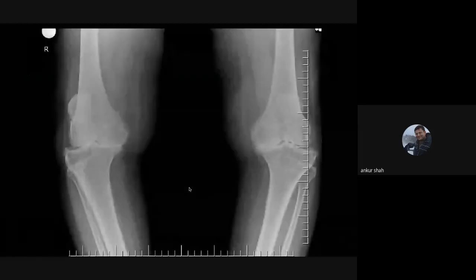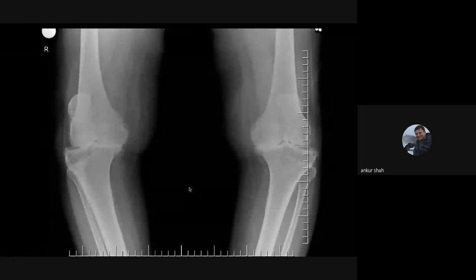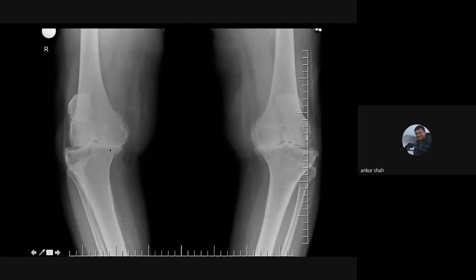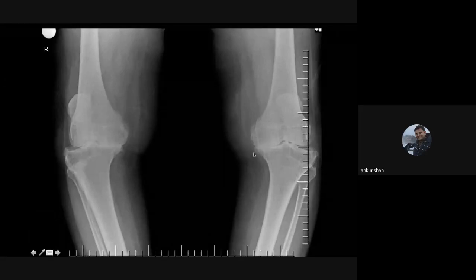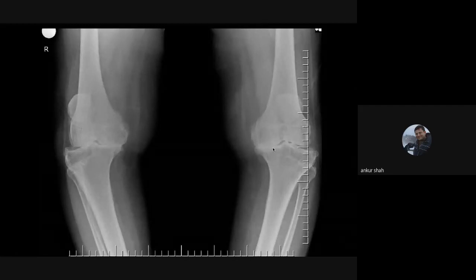This is a very common appearance seen in elderly patients who have osteoarthritis changes. There is almost complete obliteration of the medial compartment joint space and some varus deformity because of medial compartment joint space loss. The knee is bent medially, resulting in deformity with severe osteoarthritis. The medial compartment is more affected because weight bearing is greater on the medial compartment compared to the lateral compartment.